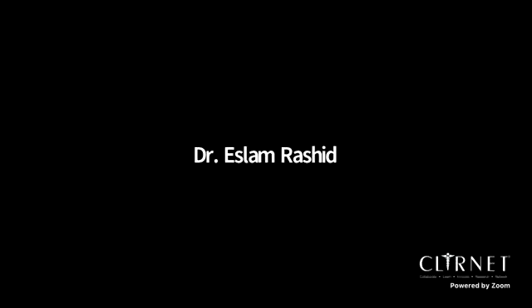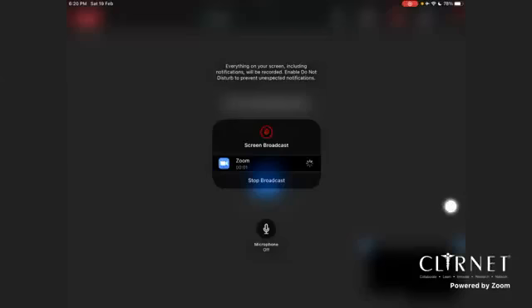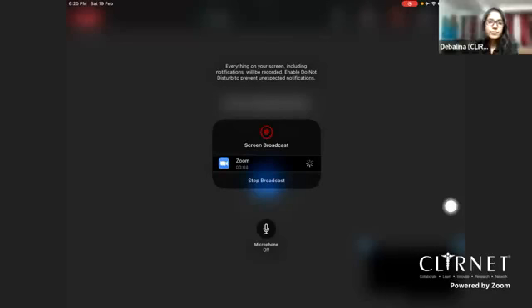Thank you, sir. Thank you so much. Another query. Yeah, I am going to show here one ECG with an example of this change.